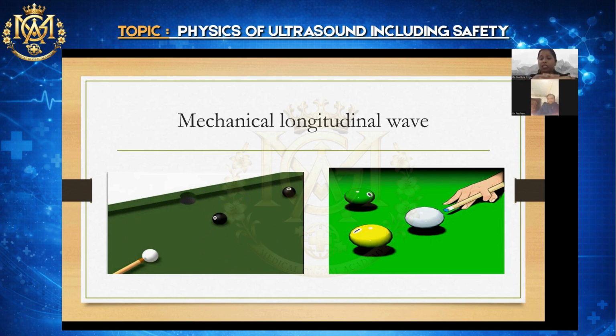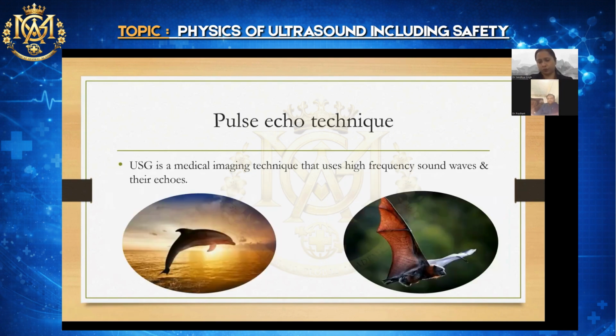That is the importance of your probe positioning. Whatever is your organ of interest, you need to hit it at 90 degrees so that maximum ultrasound waves reach that object of interest. And if maximum waves reach there, you are going to get beautiful images. This is the importance of understanding the physics. Now, once you have understood this, next slide. Yeah, this you have understood.